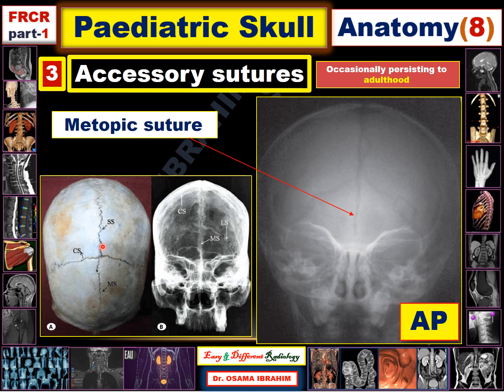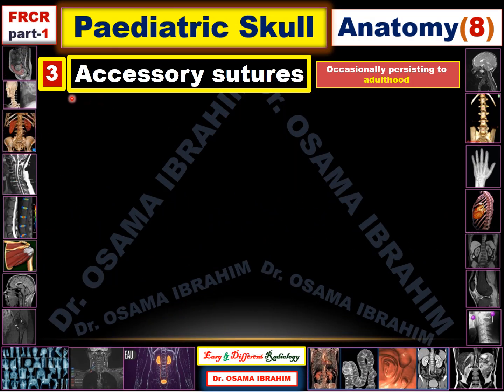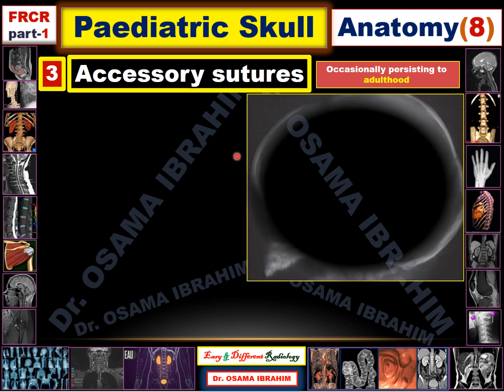Additional images confirm the metopic suture. In one view, the sagittal suture separates the parietal bones and the coronal suture separates the frontal from the parietal bone, with a persisting metopic suture also visible. Another image for a different patient confirms persistence of the metopic suture. In the anteroposterior view, the sagittal suture and lambdoid sutures are seen, with coronal sutures at the upper part of the film.